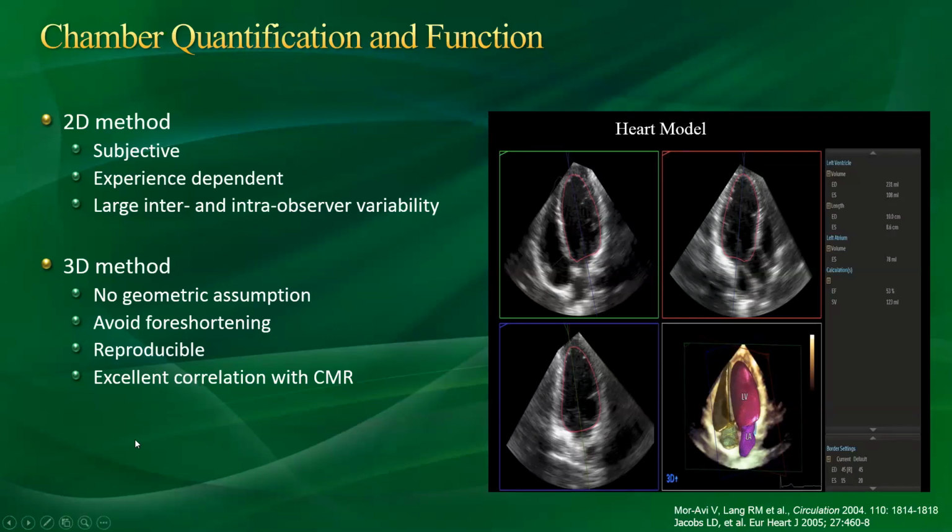What's unique about it is that it's practical because it's automated, so you don't have to do much maneuvering or changes. It knows different types of hearts, and it will fit that patient's heart shape to what matches their database. But the database has to be filled with thousands of 3D data sets.